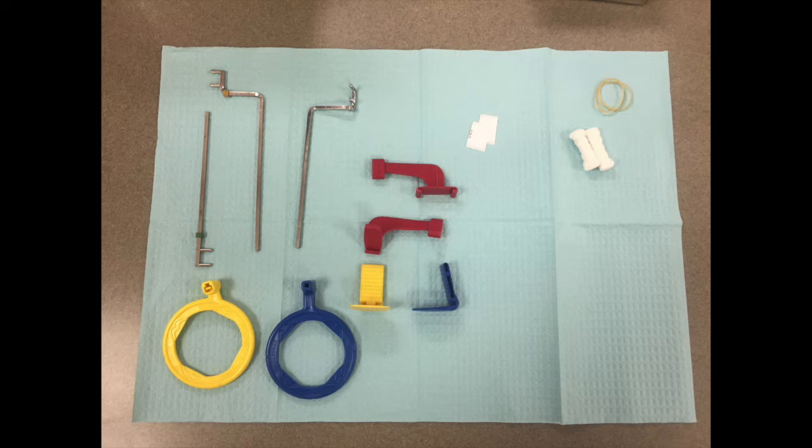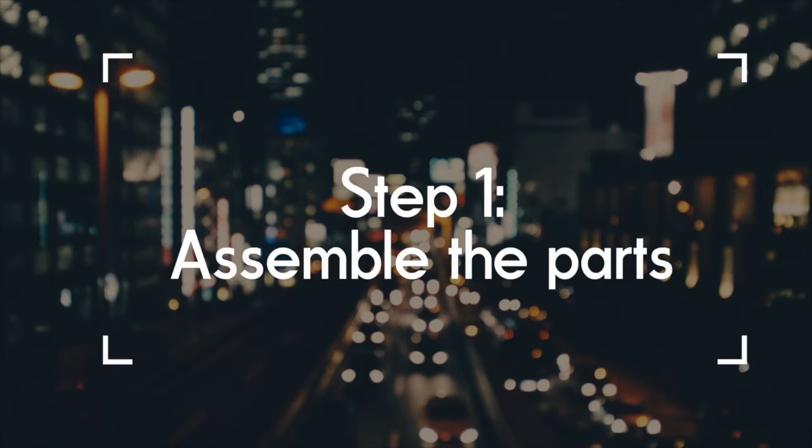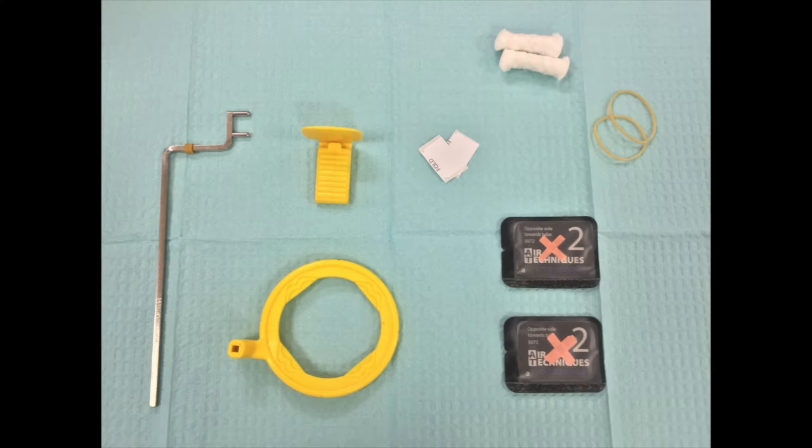These are the contents of an x-ray film kit. This is the front of a film that will face the inside of the mouth. This is the back of the film. This is the equipment that you will use for mandibular posterior periapical.